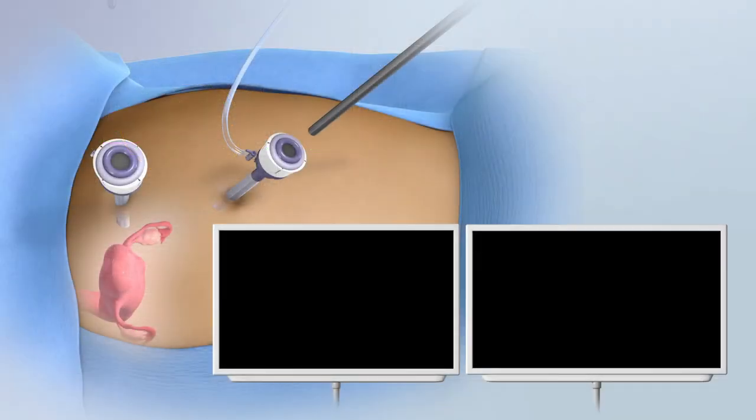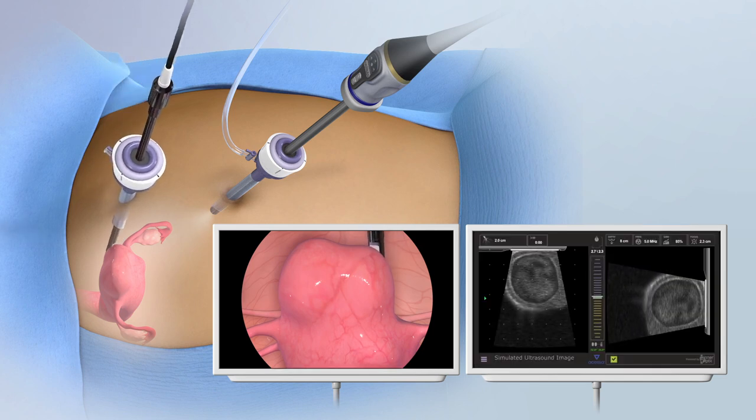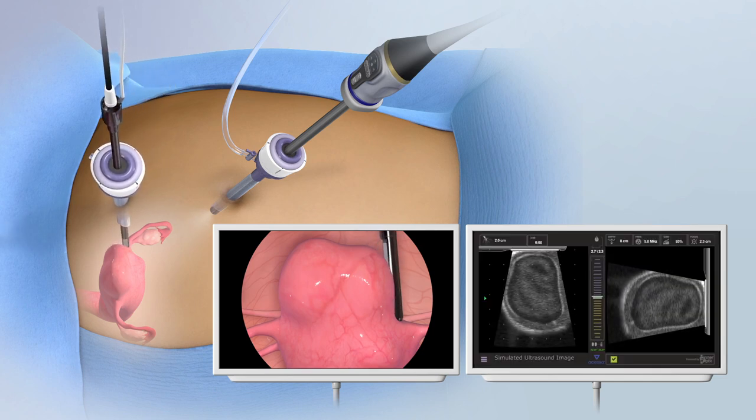The procedure is performed using a standard 5 mm laparoscope and a 10 mm laparoscopic ultrasound probe for visualization of nearly all fibroids.